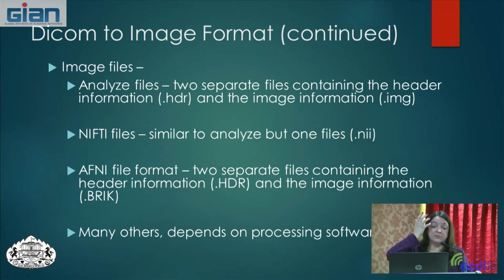And nowadays we have what's called a NIfTI file, and the extension on these is .nii. These files contain all the information in one. So instead of having the two separate files, now we have them all in one.